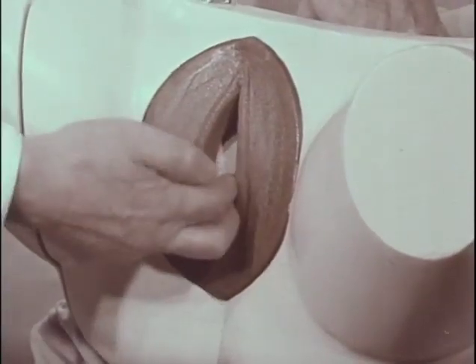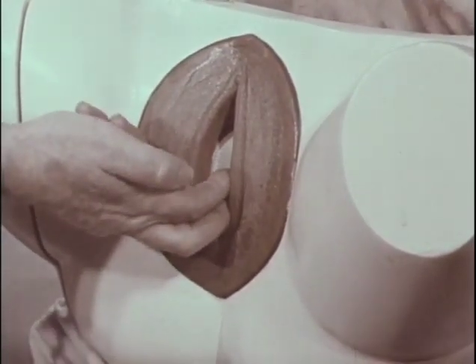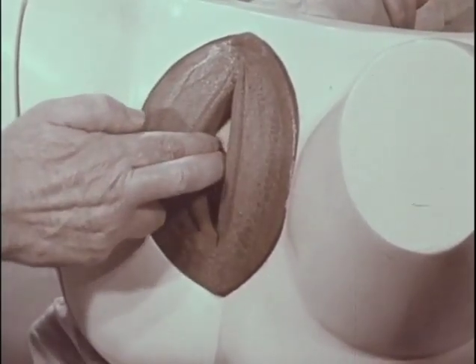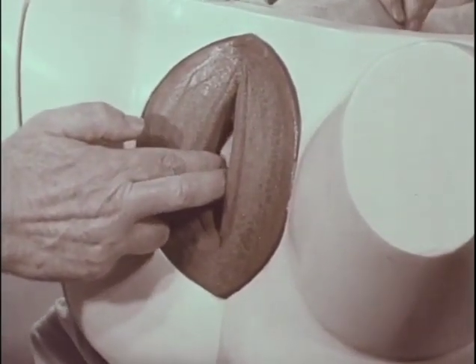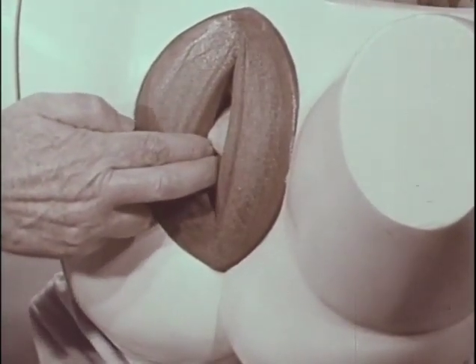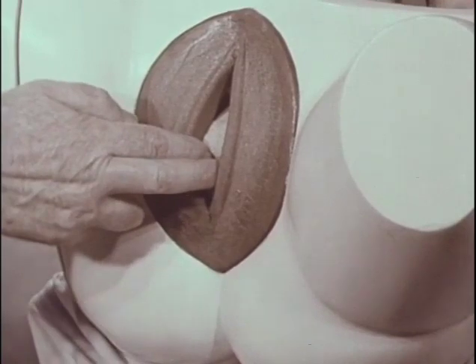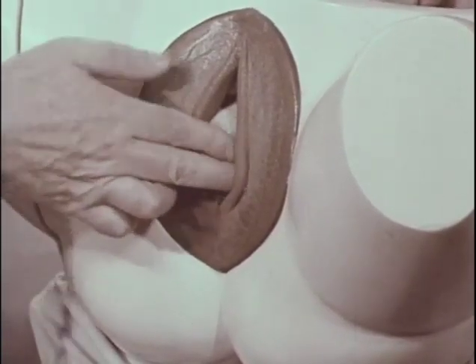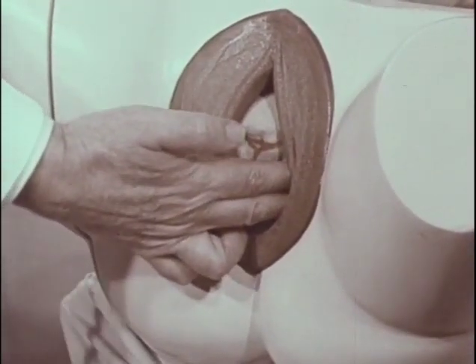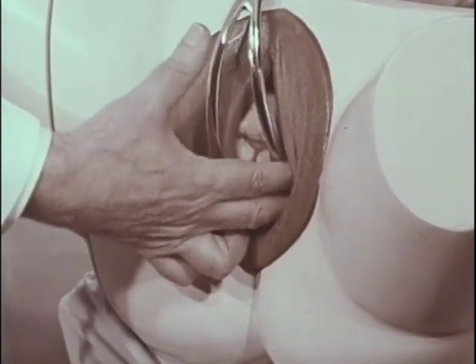Tips of the index and middle finger against the elevated edge of the anterior parietal bone. The right hand is the rotating hand in left-sided positions. Hooking, elevating, rotating maneuver, counterclockwise toward 12 o'clock. The head is rotated to anterior, aided by the abdominal hand. And then after the fontanelle is as near 12 o'clock as possible, counter pressure is given on the fundus to fix the head in the new position, and the fingers slip around to act as a splint behind the posterior parietal bone and guide the introduction of the first, the posterior, the left blade, to the left ear.